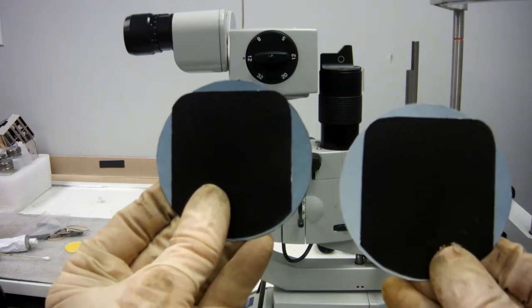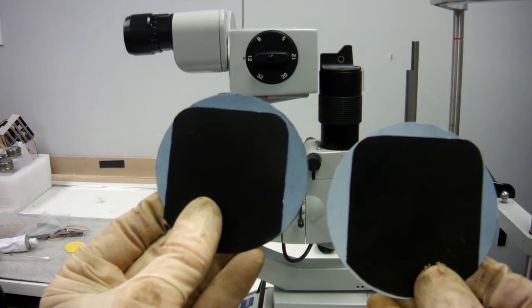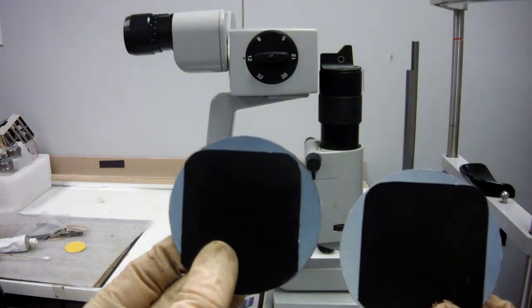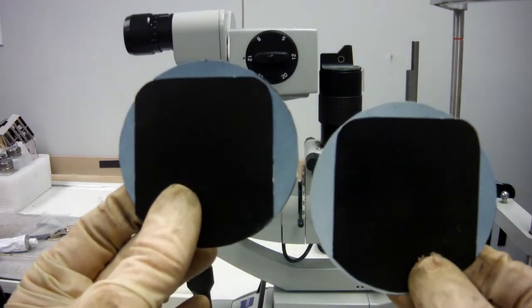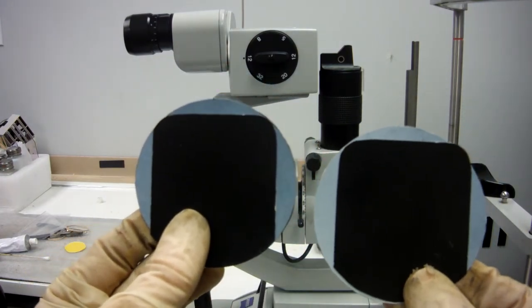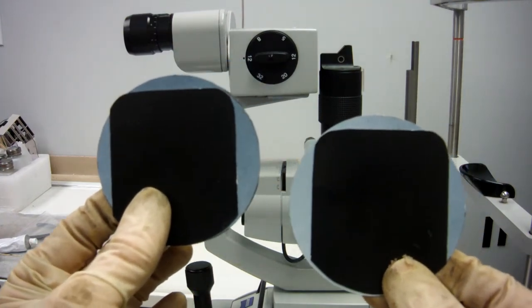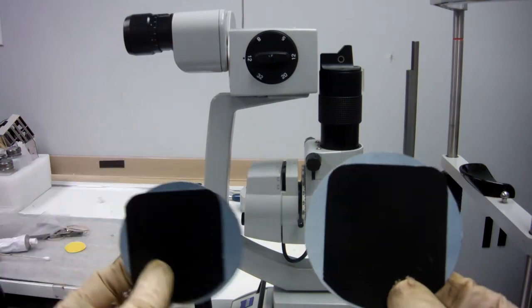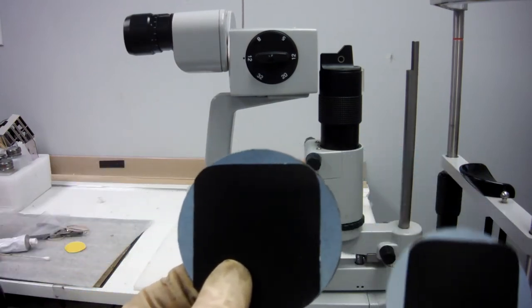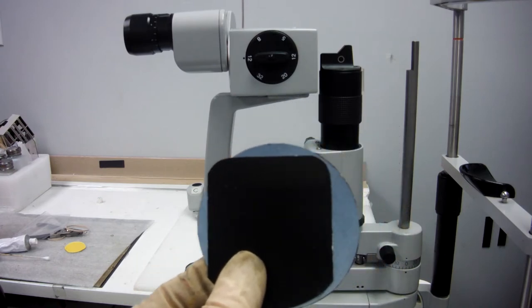Now, if one eye is off, then that side of your binocular might be out of alignment. So you'll have to determine which one is the correct one, and then align your head with the correct one, and then work with aligning the one that's out.